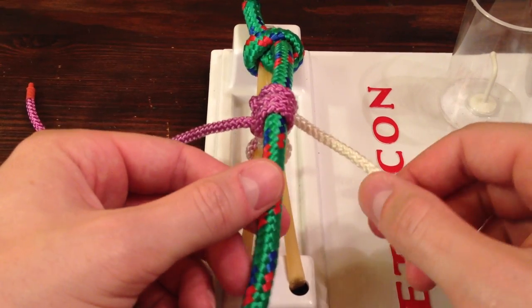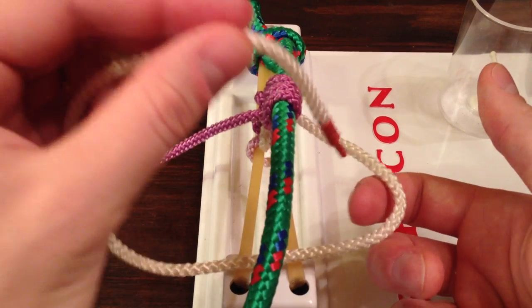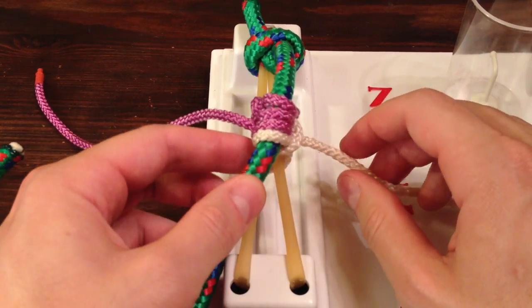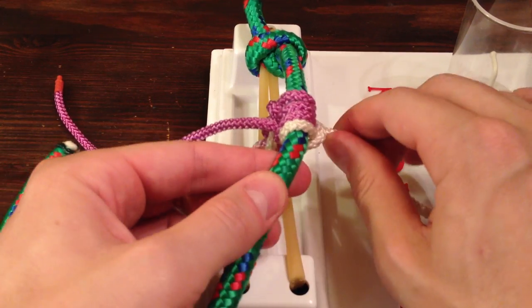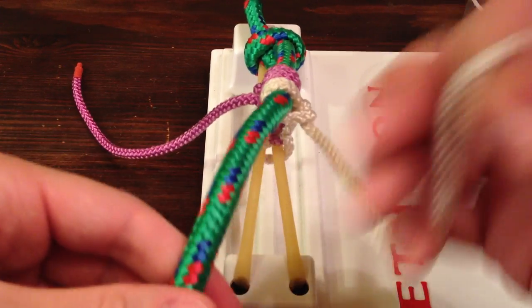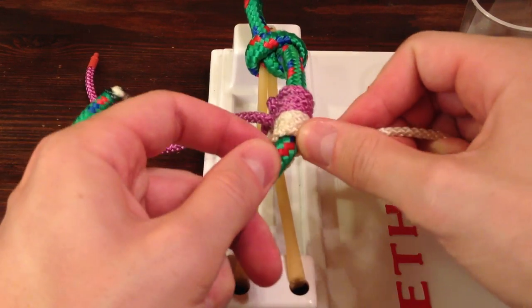We're going to move over to the right side — same thing. This time you're going to form a backwards L. Stick it through the hole and cinch it down. You don't want to cinch it down on top of the knots you already tied — you don't want it to lie right next to it. So there's one, there's two. And again, if you're comfortable with the one-handed knot, you can tie all of these one-handed if you'd like.